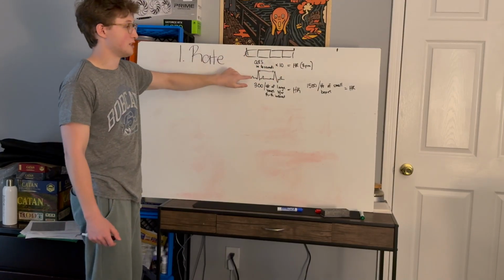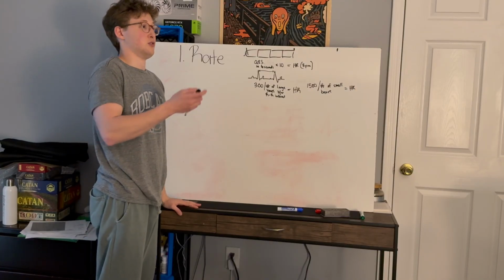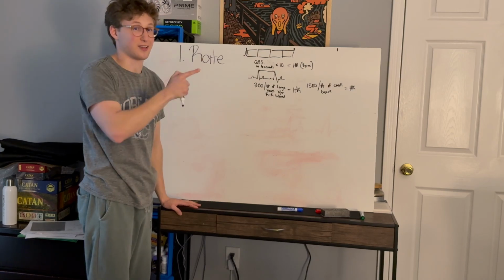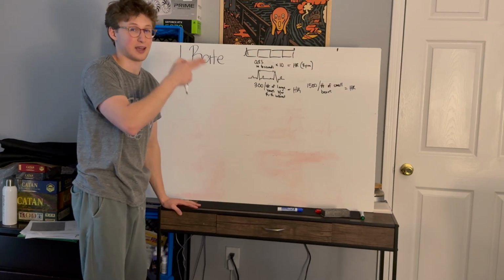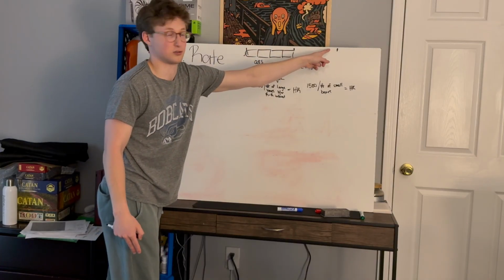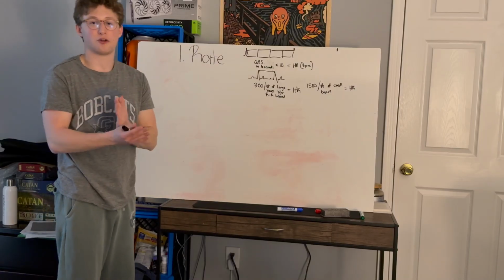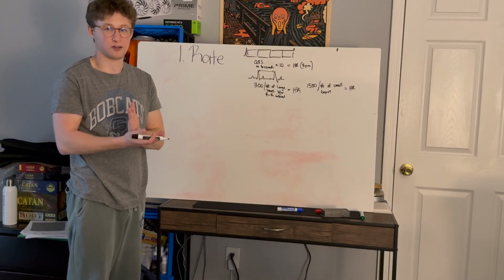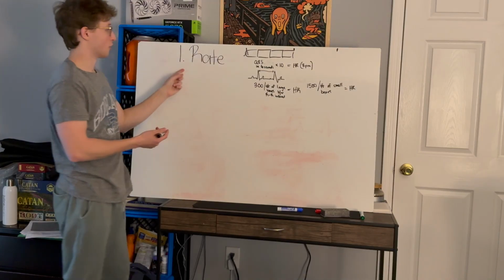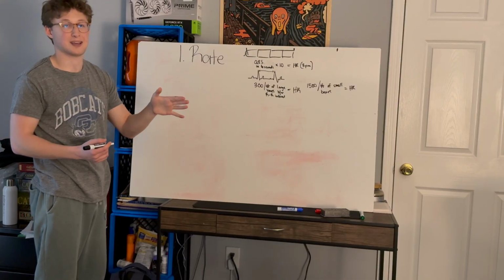So you have 3 different methods that you can do. If you really want to, you can count out the individual boxes, how many large boxes until you get 6 seconds worth of large boxes, and then count QRS complexes, but they should have those 3-second little tallies to let you know. So rate, very first thing, again, consistency. Go in the same order every time. That's how you improve. First thing you're going to do is check rate. Is it bradycardic? Is it normal? Is it tachycardic?